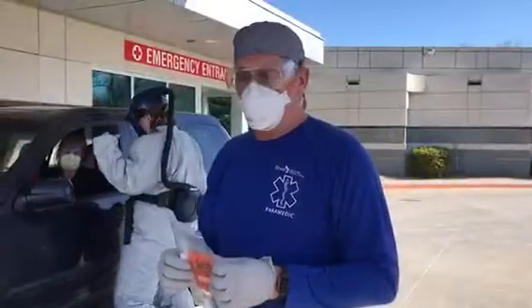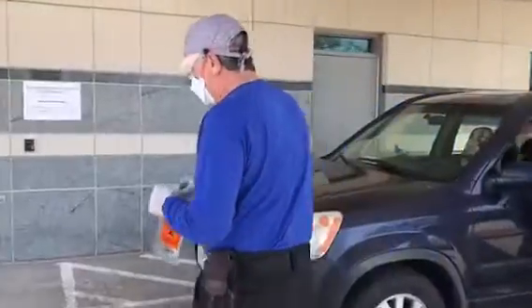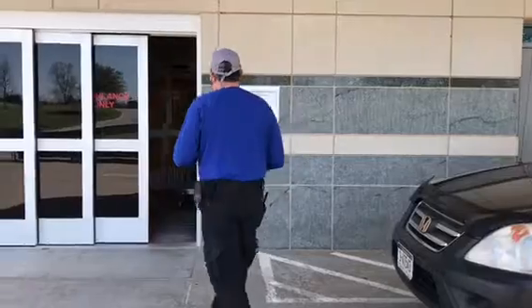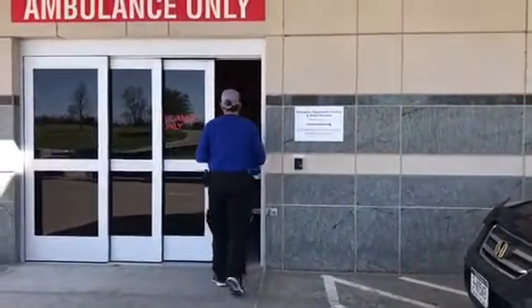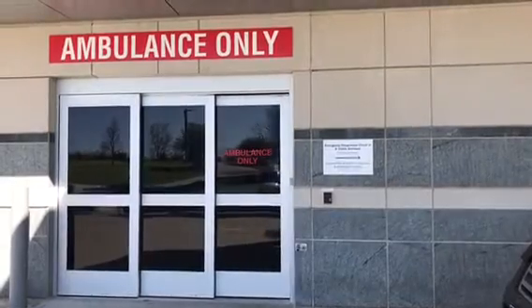The secondary nurse will then take the sample inside the building. That is where lab or another person will be waiting with another clean sample bag to place the sample in without touching anyone.